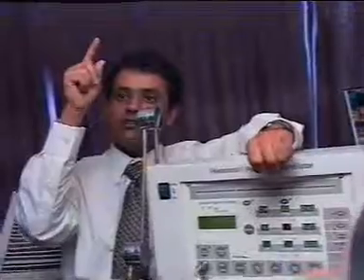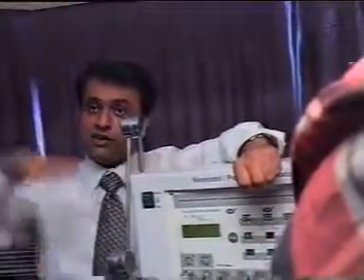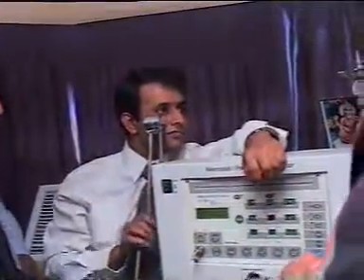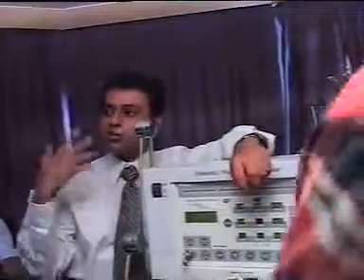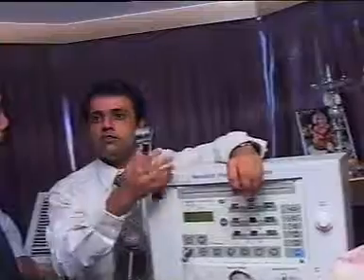Okay, tell me now, this is a question. If I reduce the PIP, decreasing the PIP, decreasing the tidal volume, what happens to the oxygen? Decreases. And carbon dioxide? Increases. Very good. What is the effect of rates on oxygen?